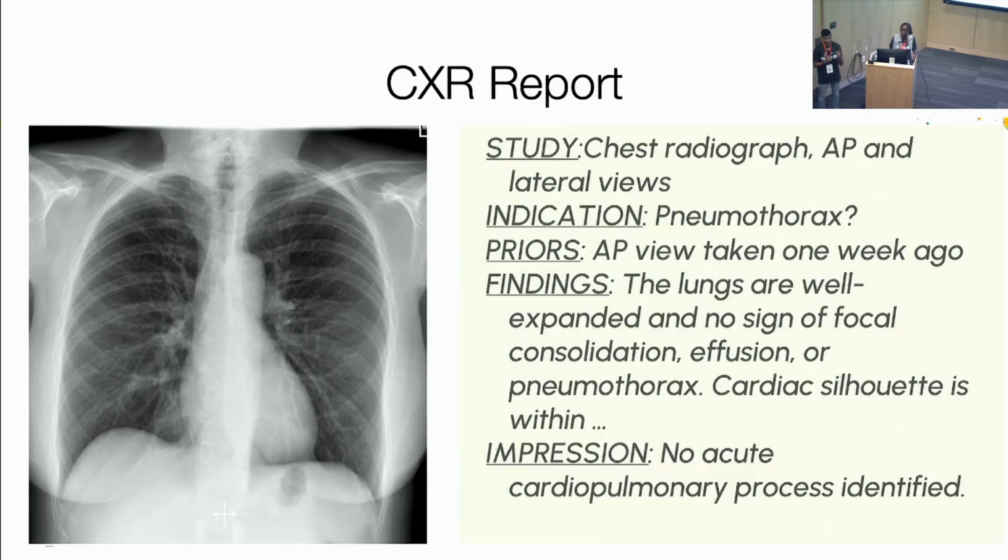And the phrasing, the words you use, may overlap, especially if it's positive, right? If the findings section for chest x-ray says left lower lobe pneumonia or left lower lobe consolidation, the impression may say left lower lobe pneumonia, right? But that's not always necessarily true. So the phrasing and the language can be different between them, but they are meant to drive you to the same conclusion if you have the domain expertise to understand.